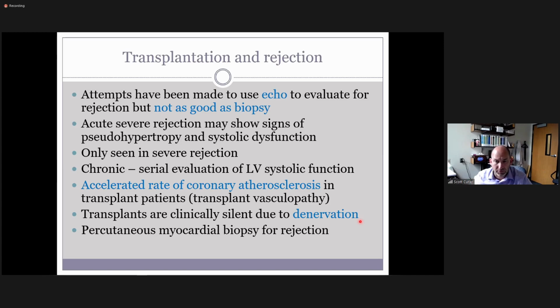We're also going to be looking at fluid collections outside the heart, and any abnormal appearance of that tissue, especially around the anastomosis area. You're definitely going to be looking at diastolic and systolic function issues, because if it's reacting and inflamed, you're going to have issues that way. Now, often when patients have inflamed heart issues, it's very painful.